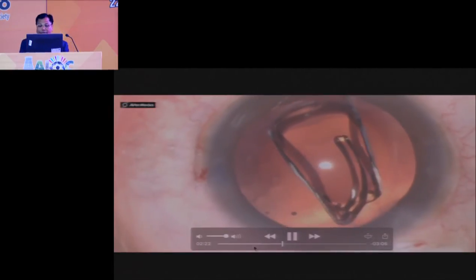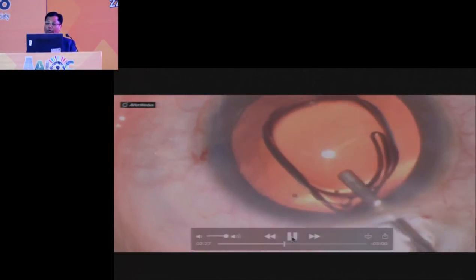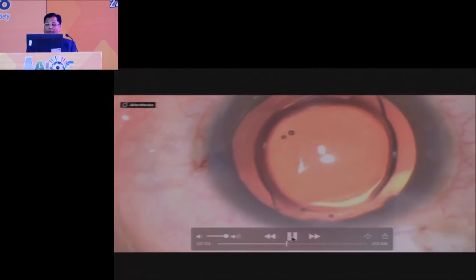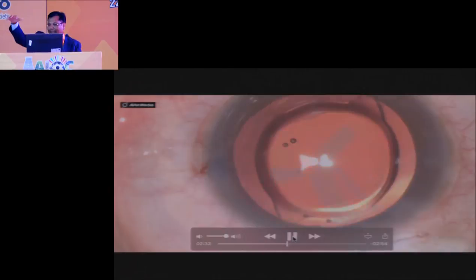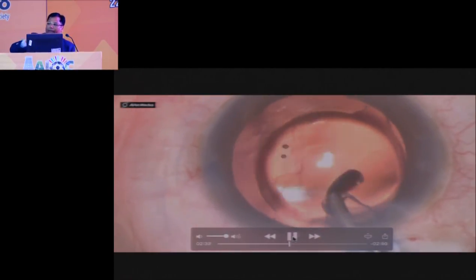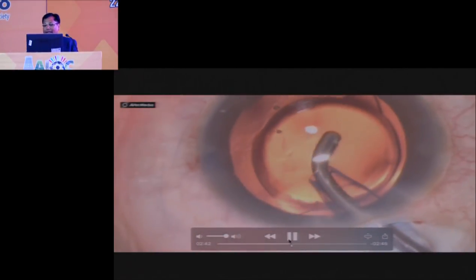Many times when you are putting the intraocular lens, because this vertical space is more, in this case, this is a hydrophobic lens, it has gone flat. Most of the time these lenses will go vertical like this. That may be the scary point, because the chamber is deep. This is the presumption of the mind before the start of the surgery, and it may go vertically, but nothing to worry. We have to place it quickly parallel to the capsule, parallel to the iris border.